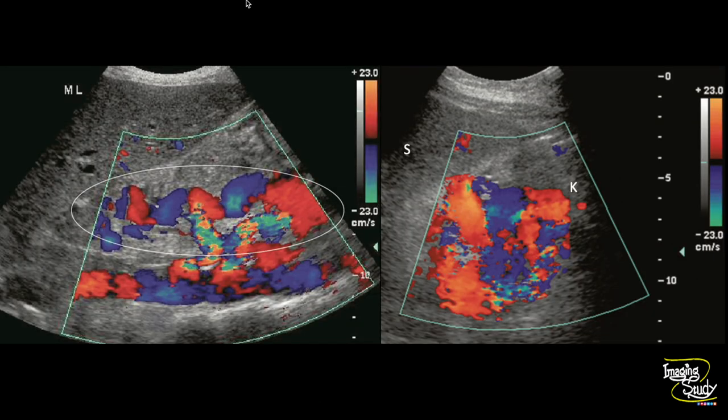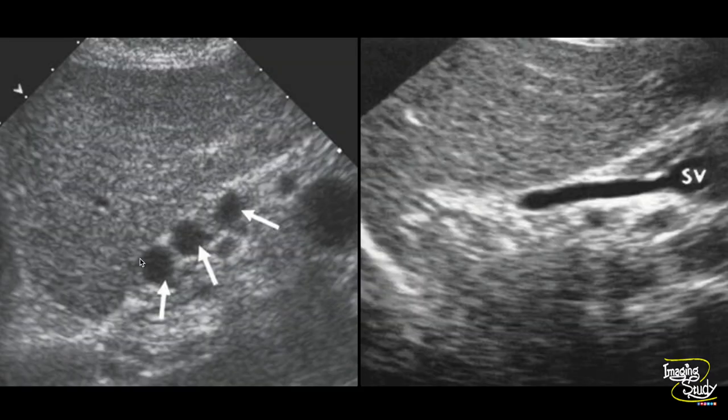Here is a longitudinal color Doppler image in the midline of a patient with portal hypertension. You can see large tortuous left gastric varices coursing from the region of the celiac axis towards the gastroesophageal junction. On the right image, you can see the splenorenal varices. Here's the posterior part of the left lobe of the liver, and you can see some dilated vessels here, which are enlarged coronary veins. On the right image, you can see the sagittal section showing the enlarged coronary vein running cephalad from the splenic vein.